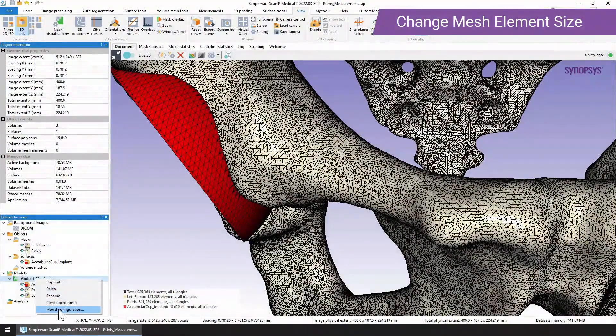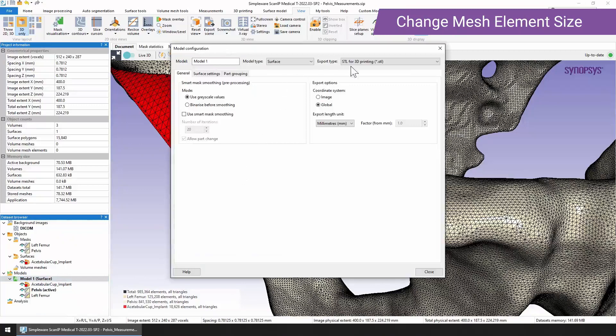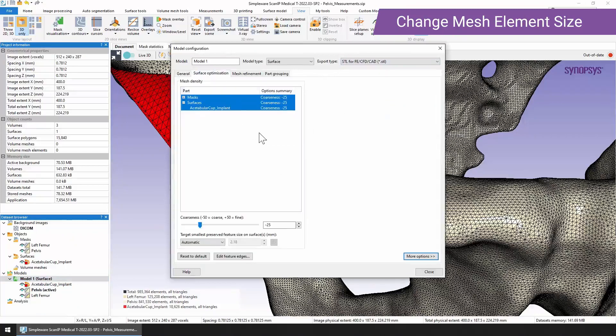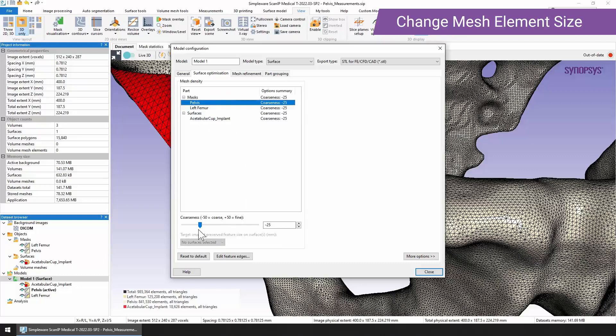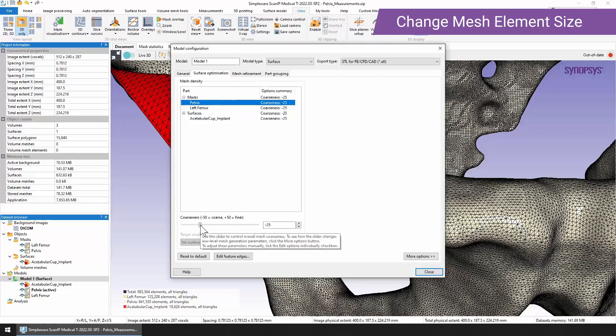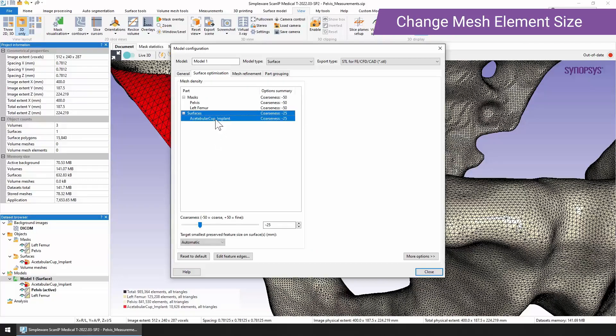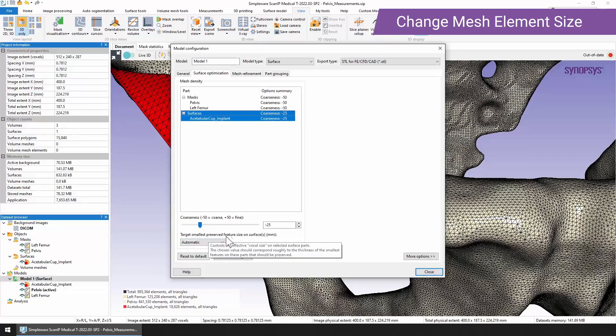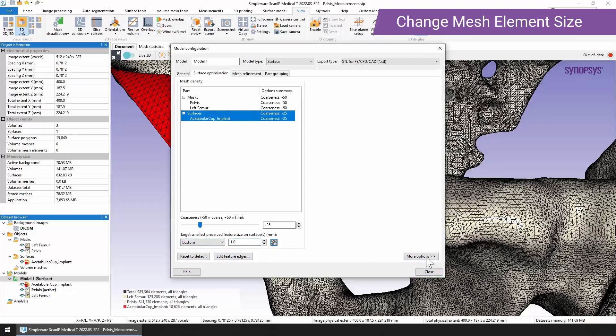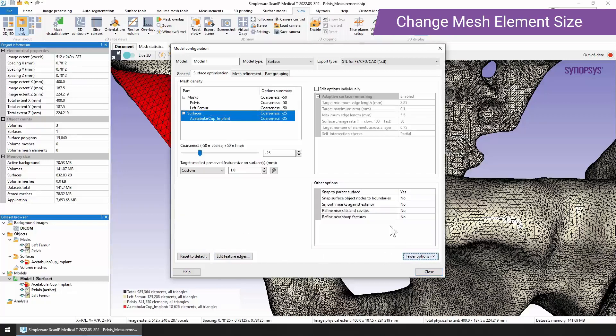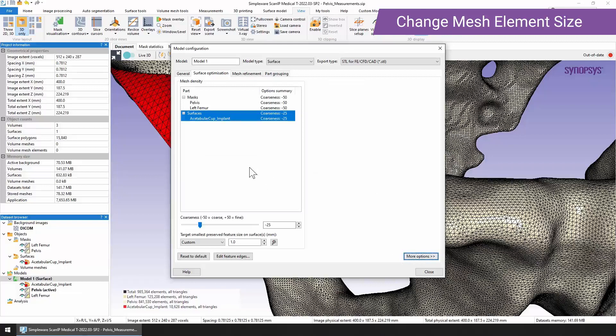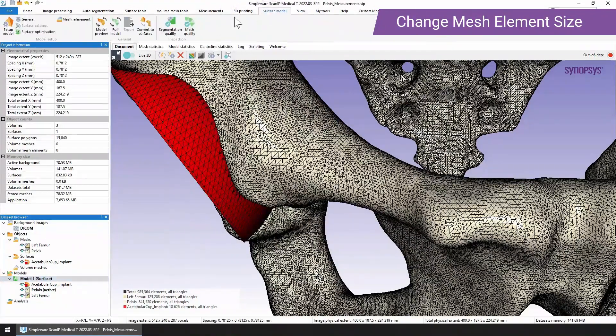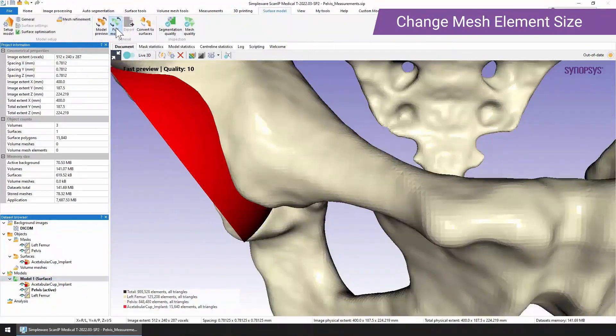Or if we go back into our model configuration and we change instead to STL for FE, CFD and CAD, we get more options for the surface optimization. Now we can go in and use this coarseness slider to decide if we want a very fine or a very coarse structure. I'd always recommend having a go at the default which is minus 25. But in this instance we're going to go to minus 50 for both the pelvis and the left femur. For the surfaces you can use the slider again but it's also useful to check the smallest preserved feature size on the surface. In this case I'm just going to reduce this down to 1mm. You can also choose to look at the advanced options, though this is not something I'd recommend initially. I'd just give it a go with the coarseness slider and then go from there. If we close this and then we go back to our surface model tab and click full model.